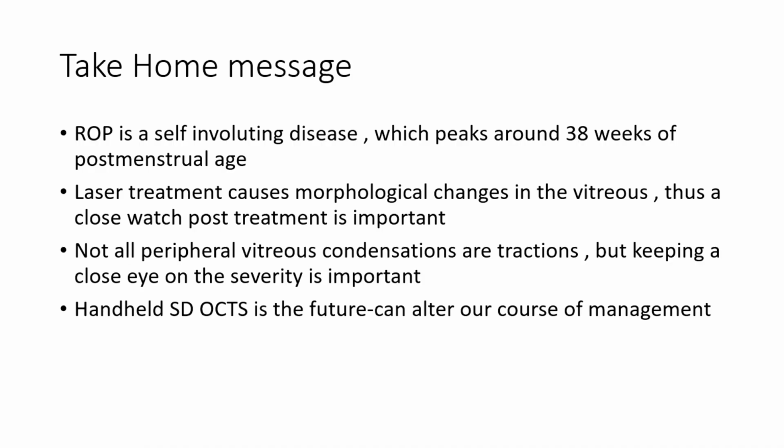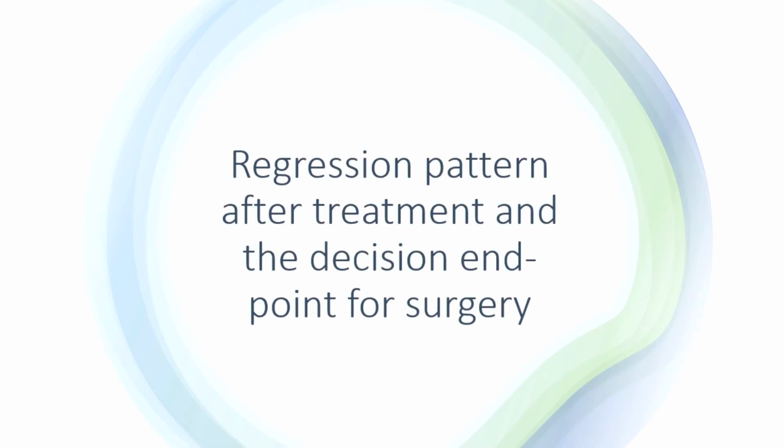So the take-home message is that ROP is a self-involuting disease peaking around 38 weeks of post-menstrual age. Laser treatment will cause morphological changes in the vitreous, thus a close watch post-treatment is important. Not all peripheral vitreous condensations are tractions, but keeping a close eye on the severity is important. Handheld SDOCT is the future. It can alter our course of management.